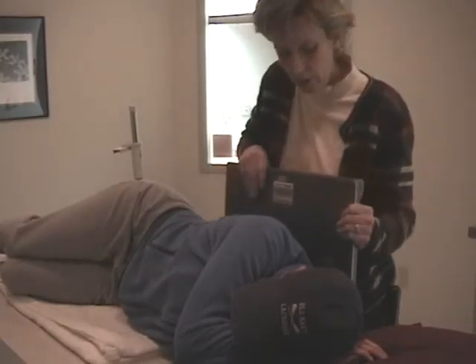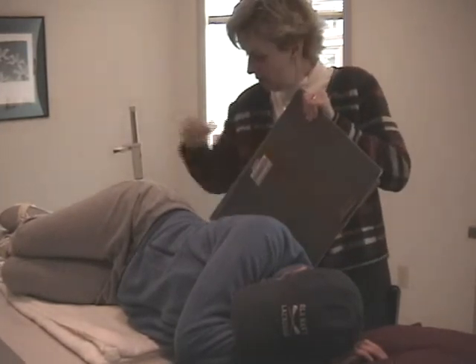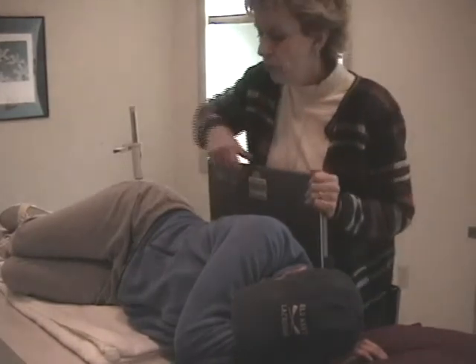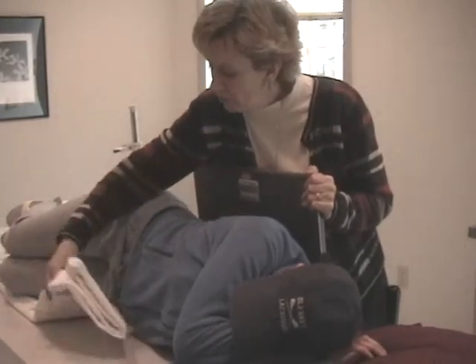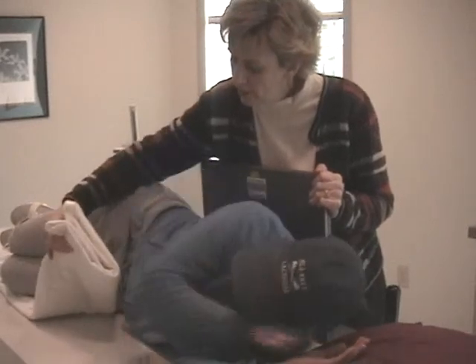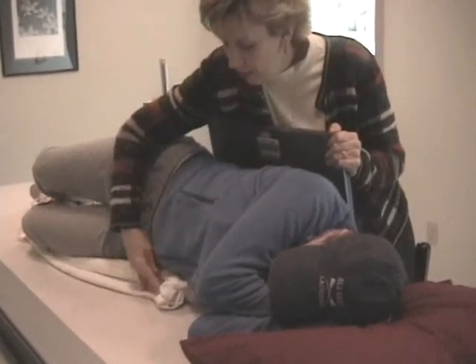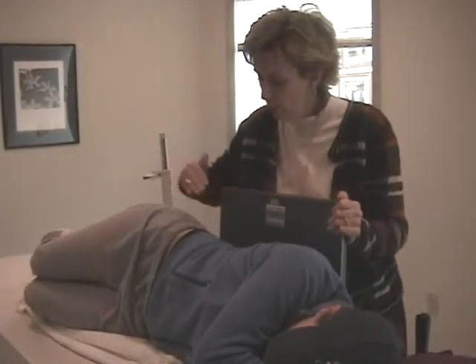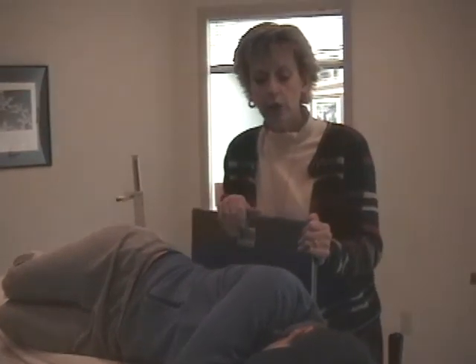In this scenario, it would be a left lateral decubitus, so I would change the right marker to a left, and I would leave the decubitus marker where it's at. Again, the patient is built up on some kind of a sponge. When we turned her onto her side, we actually lost this, but you can see how skinny I folded that blanket. So when it goes underneath her, it elevates the patient underneath her shoulders, all the way up to her shoulders, and then the cassette can drop back down behind it and shield your patient's reproductive organs. And this would be a demonstration for the decubitus chest.